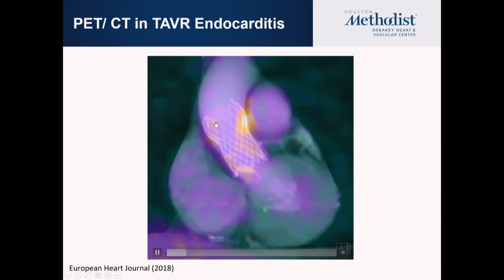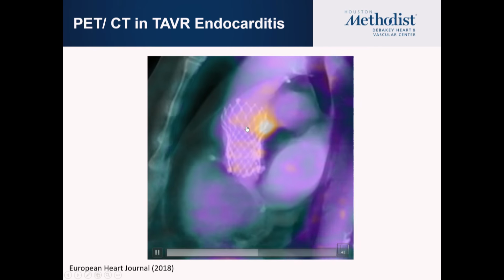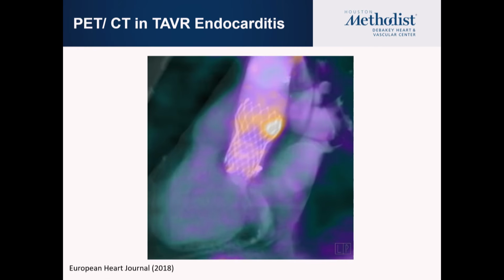So, for example, you take a target antigen from E. coli bacteria or Staph aureus, the gram-positive bacteria. So some of the common antigens, you try to target them. The problem with them is you have way more white blood cells than you have bacteria there. So the signal you get is much less. It's not going to light up as much as you see here.